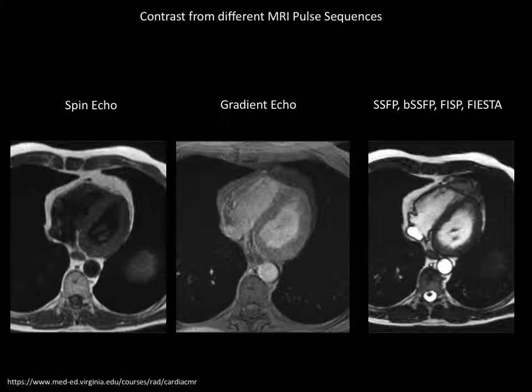to get enough energy in through the tissue to see the heart, except on MR, basically radio waves don't get attenuated that much by tissue, and so you have a fairly transparent view, and you can get these remarkably different contrast images by simply changing the pulse sequence. So we saw in our principles, you can make blood in the descending aorta entirely black, dependent on the flow of that blood, or entirely bright, dependent on the flow.